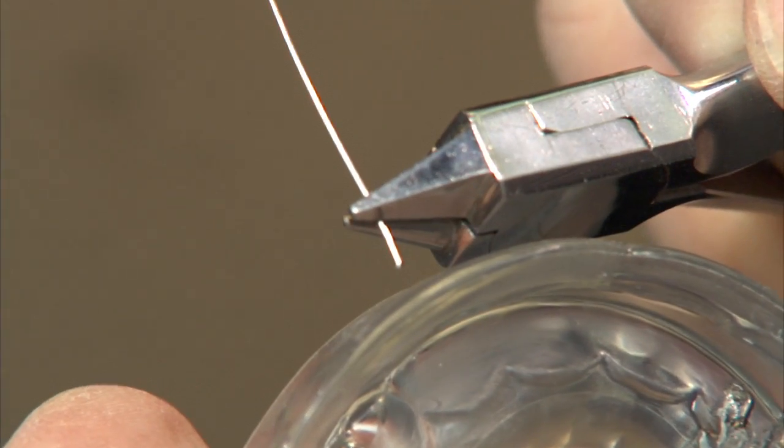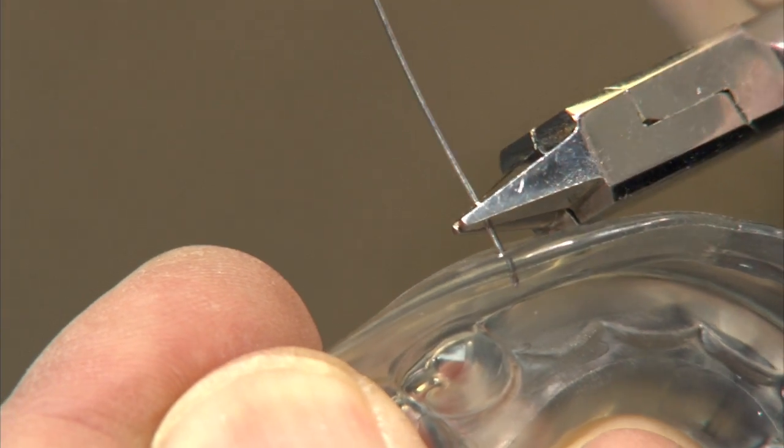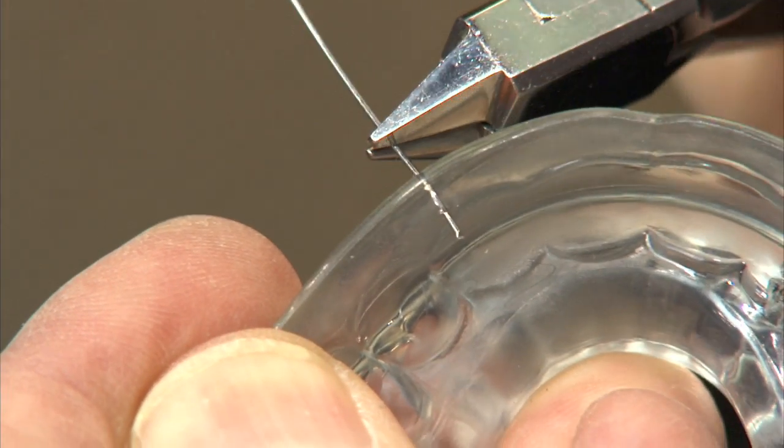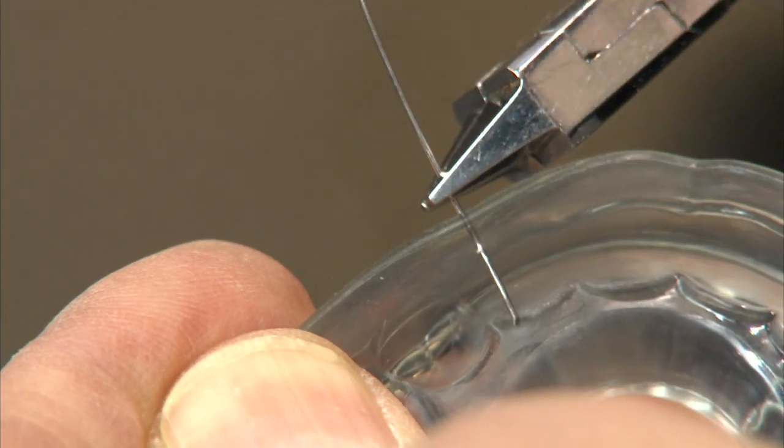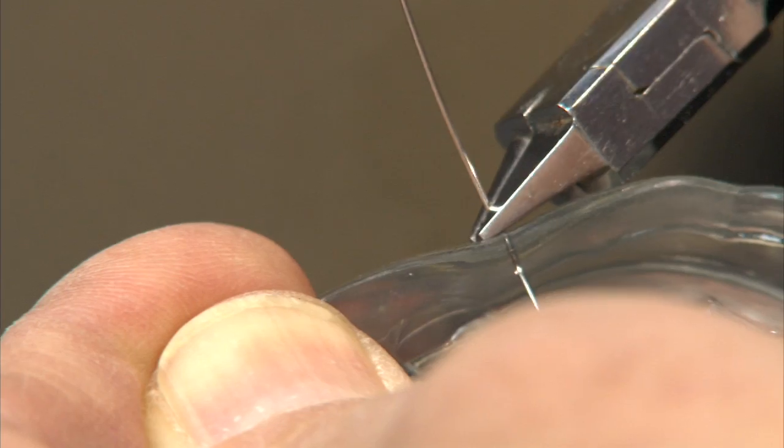We insert this wire into the appliance where we want it to go through. We push it into the lingual, leaving about a millimeter of material above that wire.